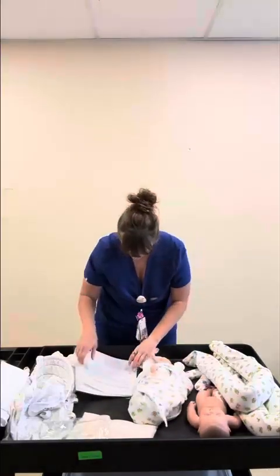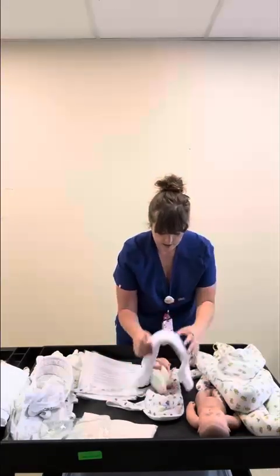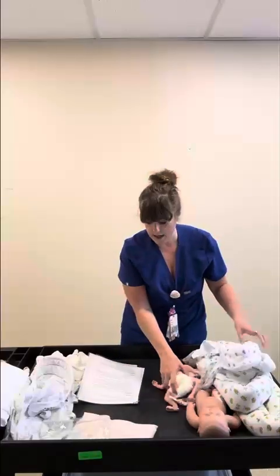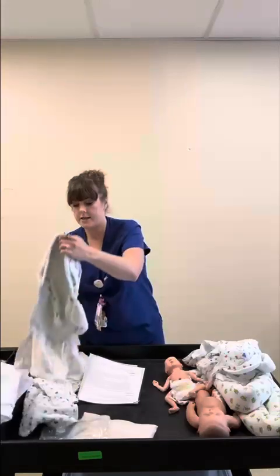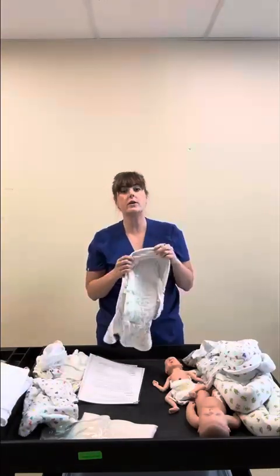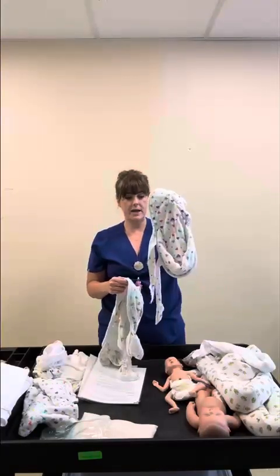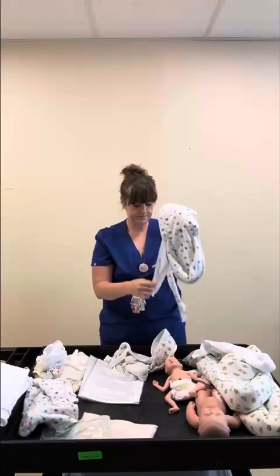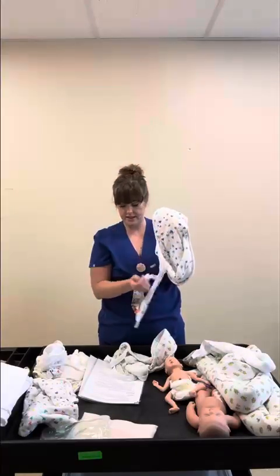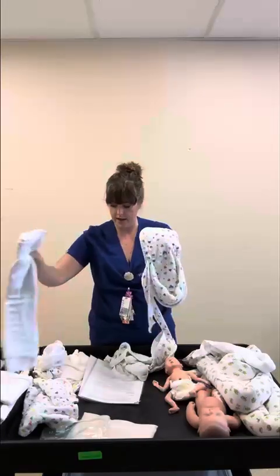Okay, next we're going to talk about the RU2. So when your baby grows a little bit and is now in that 1,200 gram range and bigger, you can utilize this RU2. If your baby's smaller, you can still use it, you just can't use it fully with the whole swaddle component. So this is made so that you're not swaddling them inappropriately. I get that the straps are a little more flimsy, so if you need to have a cloth diaper for like an extra strap of containment, that's okay.